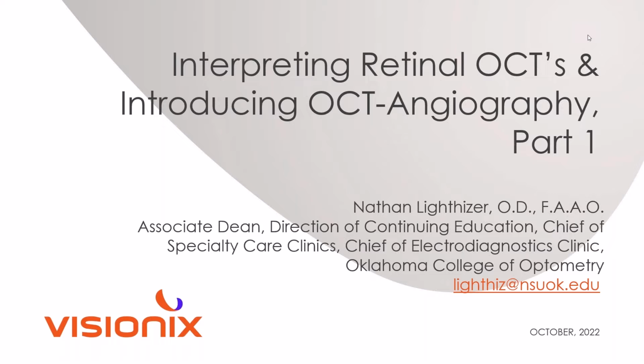So interpreting retinal OCTs and introducing OCT angiography. These are two really important and popular topics.